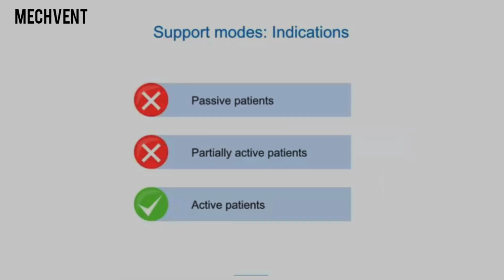The ventilator delivers a spontaneous breath immediately after a valid patient trigger is detected. Otherwise, it keeps waiting. Therefore, support modes are indicated for active patients only. Always enable apnea backup function in a support mode for patient safety.